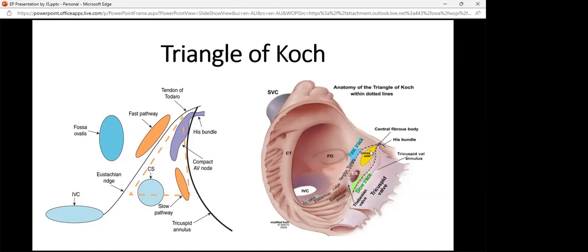To your point, Jarrad, while you're doing that, it also helps with programming of your PVARP, the post-ventricular atrial refractory period, so you don't get PMT. So I think a recommendation for anyone is to check for VA conduction, because it can help with your diagnosis later, and also because it's proper programming of PVARP as well. Yeah, exactly.